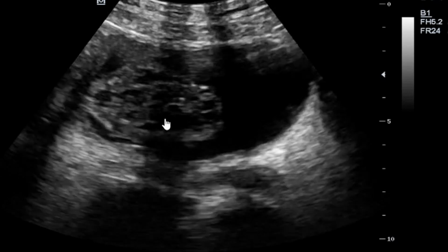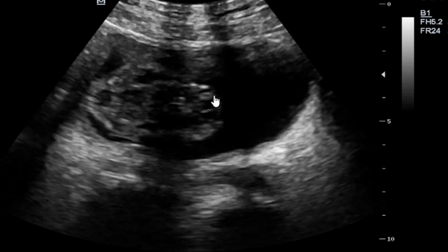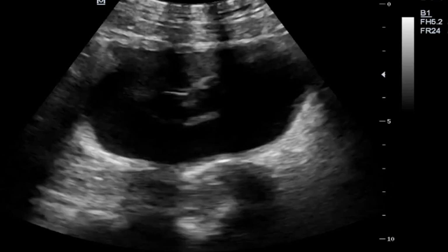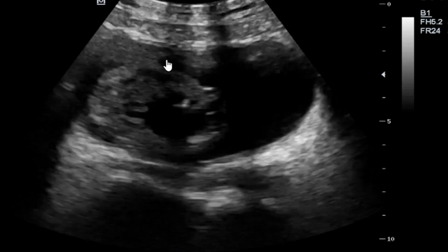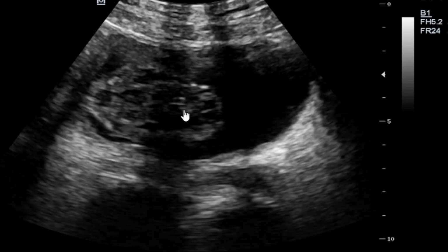When someone is bleeding in the urinary bladder, or there is a bleed from the kidneys, the blood can accumulate in the urinary bladder and form a hematoma. When there is an external or foreign body in the urinary bladder, the blood can clot around that foreign object. In this case, we have our catheter bulb, and you can see the clot forming around it. So this is a typical example of an organizing hematoma in the urinary bladder, a vesical hematoma.